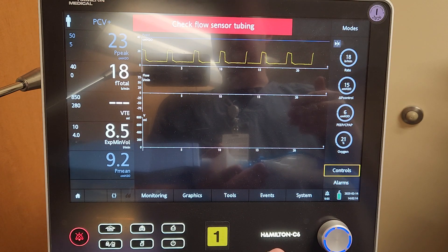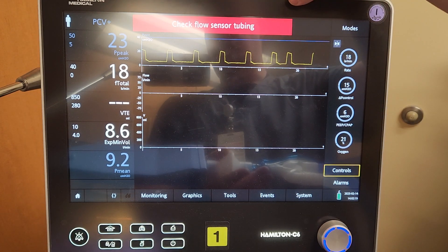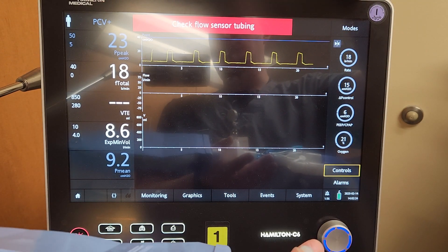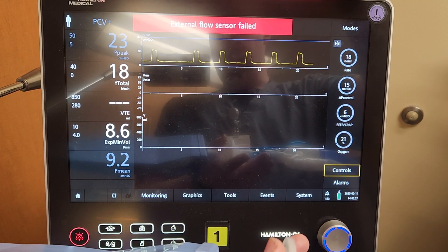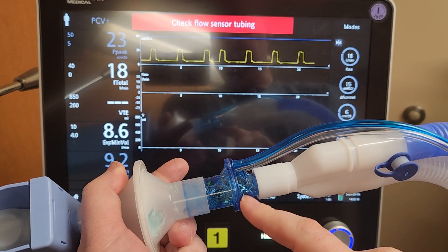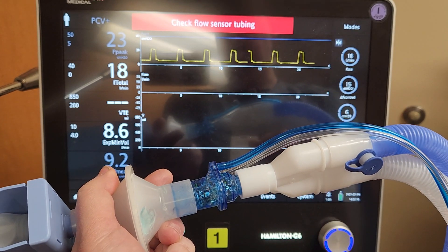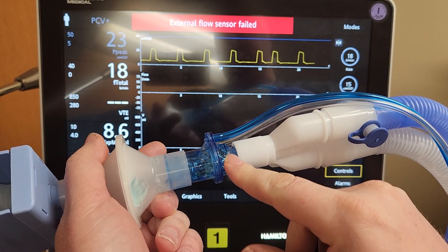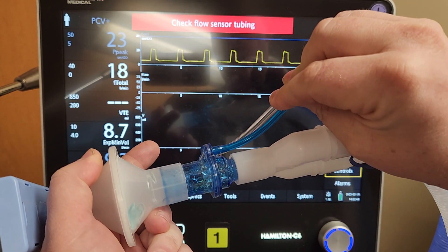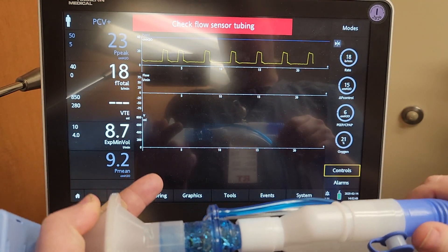We need to be assessing the patient — are they actually breathing? Do they have chest rise? If they are, notify the RT and say 'I've got a red light and an alarm saying the external flow sensor has failed — would you mind coming to fix it?' The RT will look and determine if the flow sensor needs to be changed or can be fixed. Common causes are the patient coughing something into it or fluid collecting in the tubes.